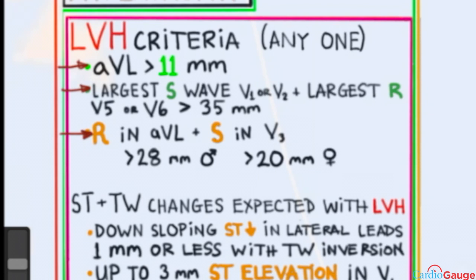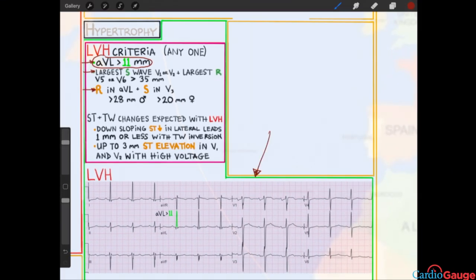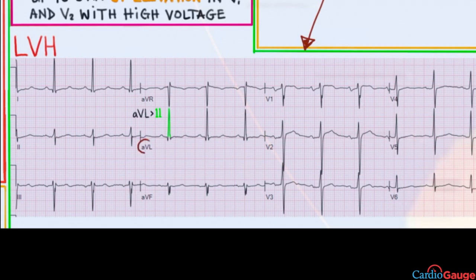I don't find that necessarily to be true in my clinical practice, but that's what the science says. The first criterion is AVL greater than 11 millimeters. Looking at the EKG tracing, the height of the QRS in AVL is more than 11 millimeters — something like 14. I find that easy to remember because AVL, L looks like a 1, and then there's LVH. So AVL greater than 11 is almost impossible to forget.